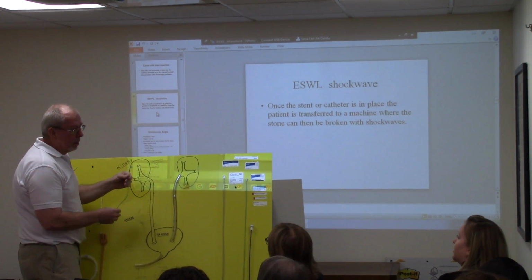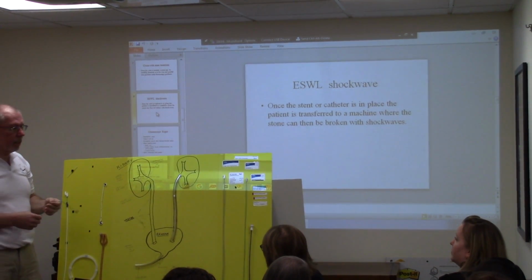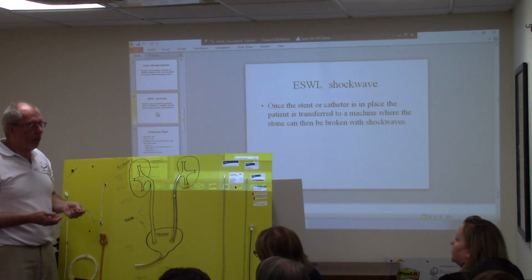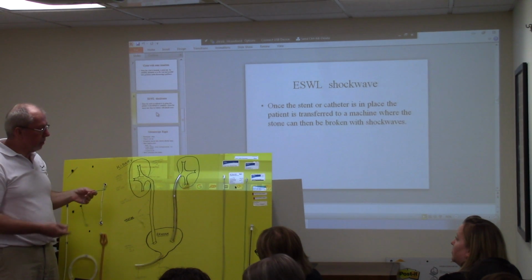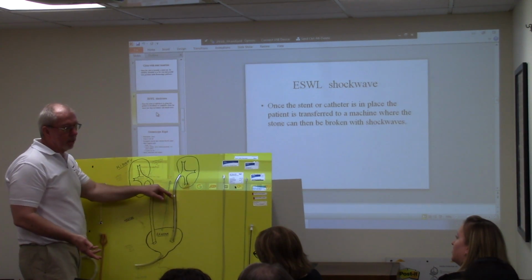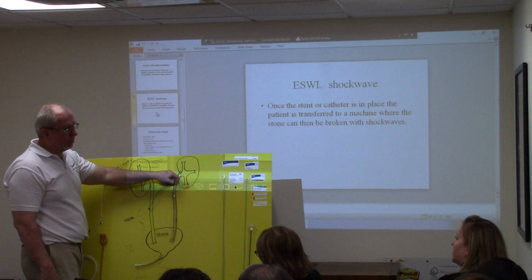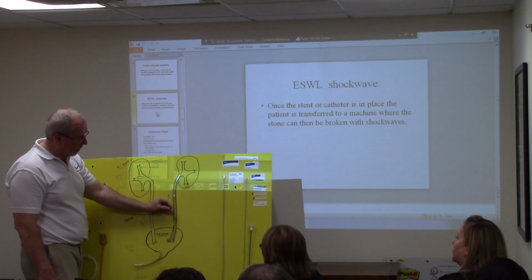I know sometimes you'll start off with one and then they'll switch to another. Correct. Yeah, because a lot of times they'll say, oh, how tall are you? Oh, you're 5'4". So they say, well, give me a 22 centimeter. And then when they put it in, it's sitting right here. It didn't go all the way up, so then they'll have to take that out and put in a longer length so that it sits up here on the top. And it has to sit here and it has to sit here.